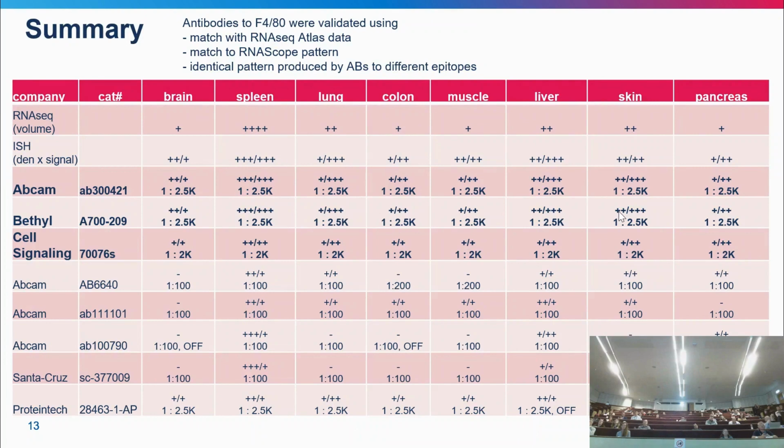For us, we have this table. This is all incorporated in our LIMS system, where we rate all the antibodies. The great thing is we would like to have all 3 antibodies on record. So if one of them is discontinued, we have another one. And if a new tissue is coming, we do test all our leading candidates here.